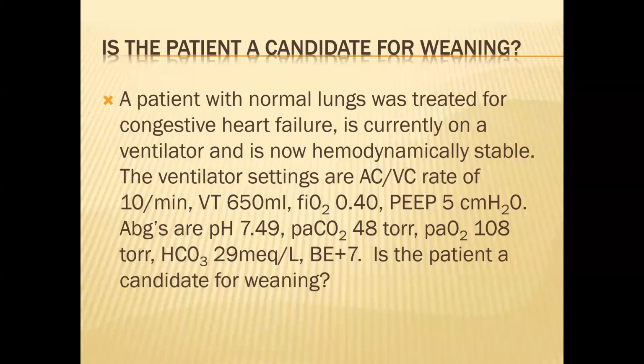All right, so the patient's stable on AC/VC, rate of 10 per minute, tidal volume 650 ml, 40%, 5 of PEEP. pH is 7.49, PCO2 is 48, PaO2 108, bicarb 29 with a +7 base excess. So is the patient a candidate for weaning?